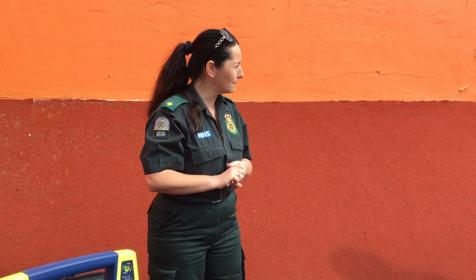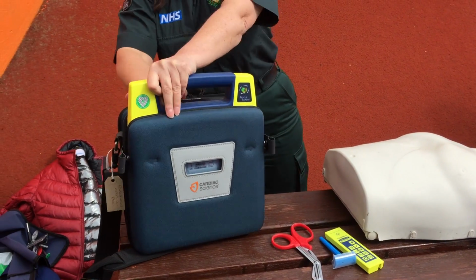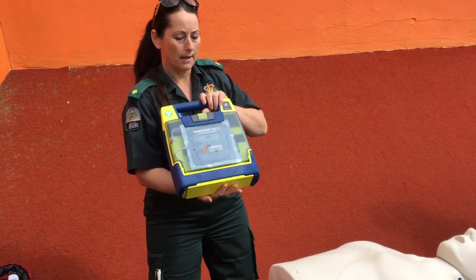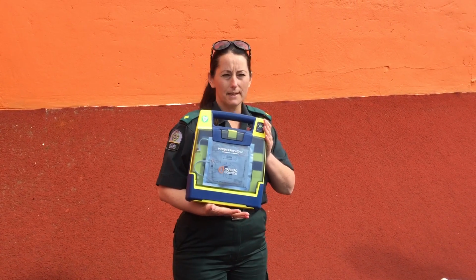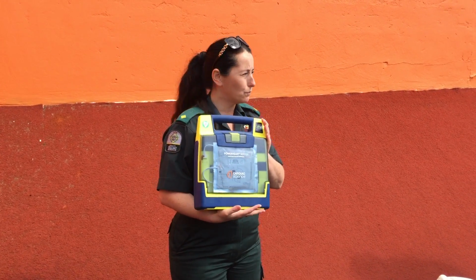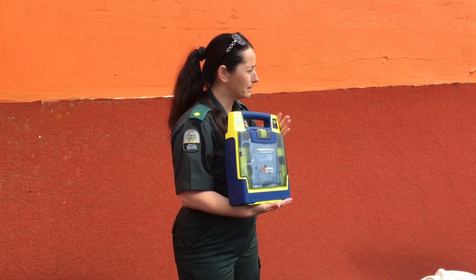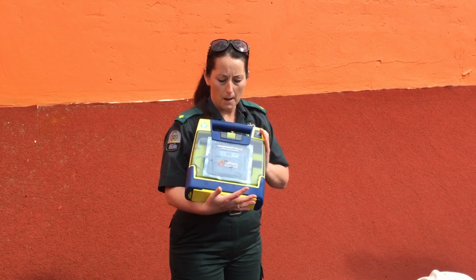Defibrillator wise, has anybody ever seen a defibrillator before? Yeah, a few? Okay then. So this is the one that's actually at the pool. It's a Cardiac Science G3 defibrillator. Unless you've got one of these, you've got less than 5% survival chance. It has over 75% success rate, the defibrillator. So they are great machines to have. They are going up everywhere at the moment.